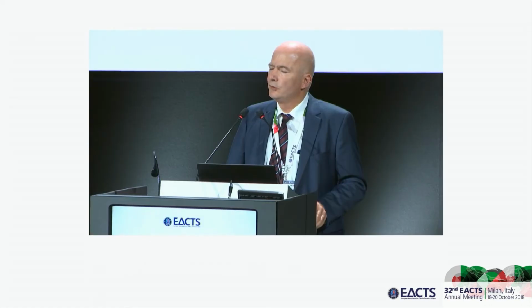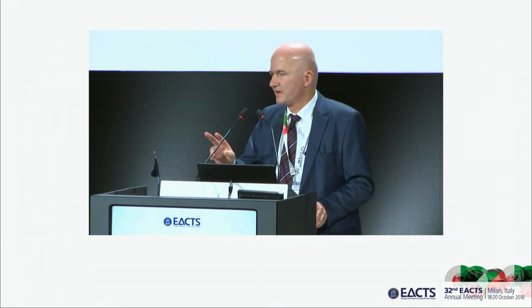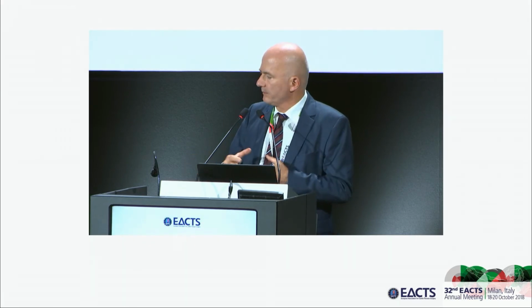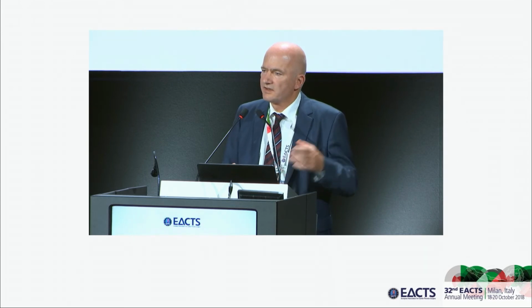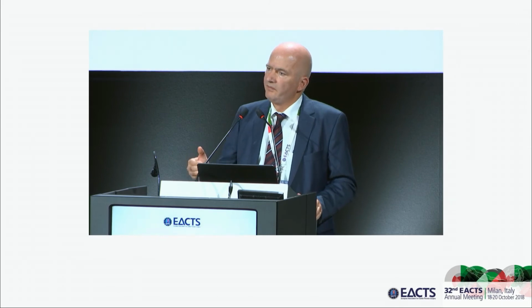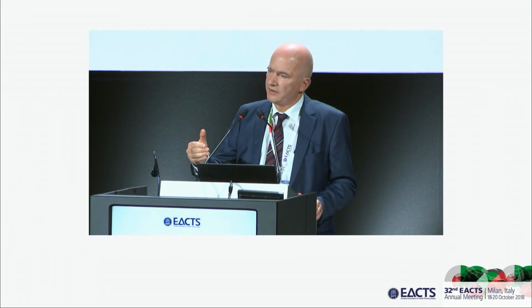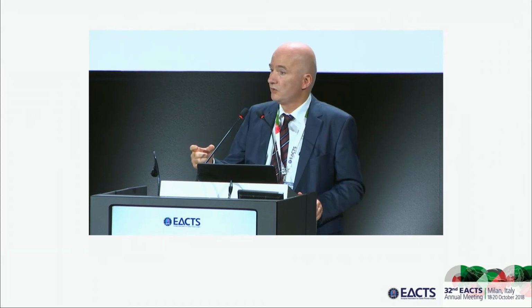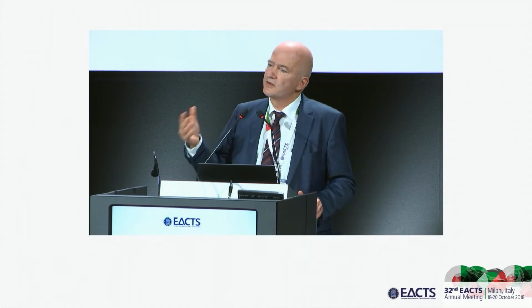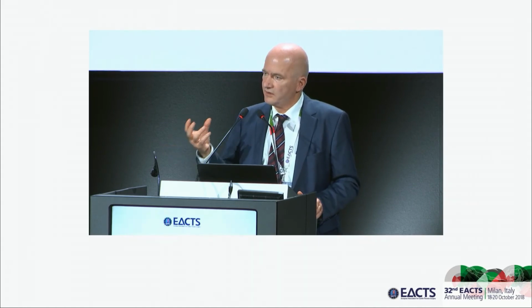I do not fully agree. If we do a 3D, there are a couple of systematic errors. One is there is a difference between annular size on the cardioplegic heart and on the beating heart. And this is a systematic error between any imaging and intraoperative determination. Second, the left ventricular outflow tract in diastole usually has an oval shape. So the key question is which diameter do we take, the shorter or the longer? But then it also changes during the cardiac cycle. It becomes circular during systole.